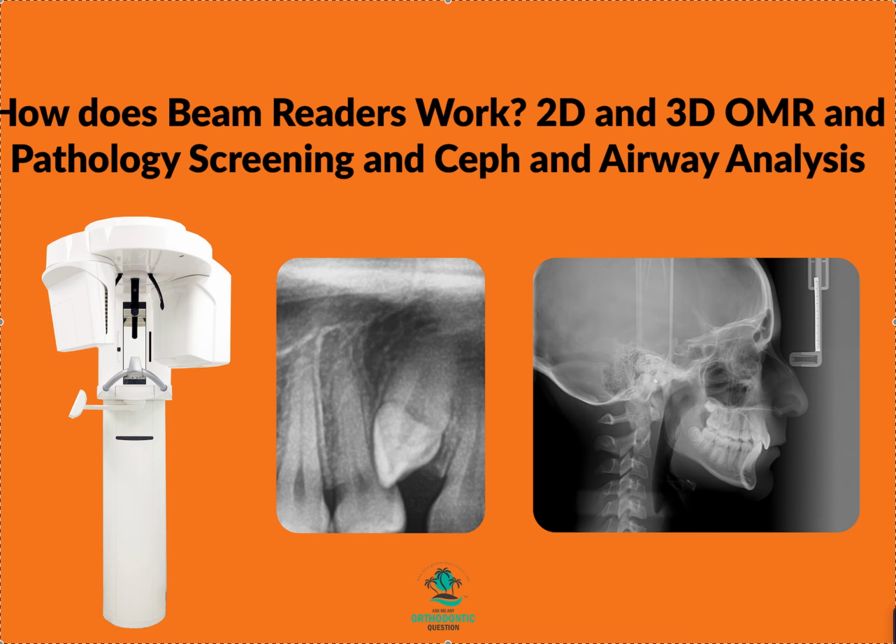Before, I used to always send the patient, because we didn't have a CBCT way back when. So we would send our patients to the OMFS, and then they would read it. And they're pretty good at it, but that always took a lot of time. So if you have the technology, you can knock this out in a few days and get your answer ASAP. Can I go ahead and start the case? Is it okay for me to distalize? Is this pathology something that's concerning that needs a biopsy, et cetera, et cetera.